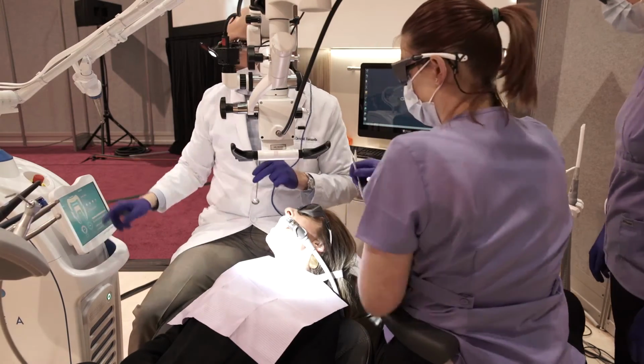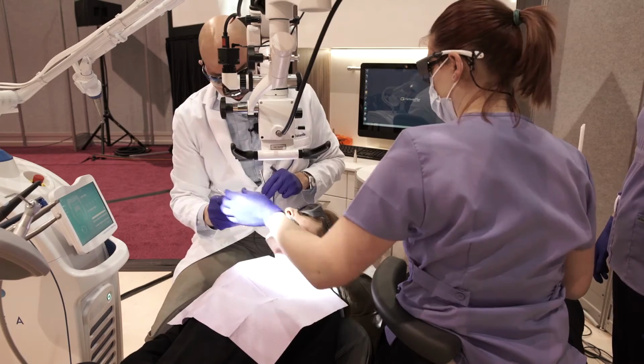Diving down even more, then you look at, is this laser going to be reliably anesthesia-free? He said 95%. I'd say I'm at that or above. So what if that was 50%? If I'm not reliably anesthesia-free, that patient comes in the door, I don't know whether that patient's going to be the person who's going to feel it and I got to stop and numb up. Now your efficiencies are gone. So you really want to look at whether it's reliably anesthesia-free. You want to look at whether the tool itself can do it, so for example, cut blood-free. And then when it comes down to it, it's got to be able to touch multiple facets of the practice. I mean, your thing is every patient every day.